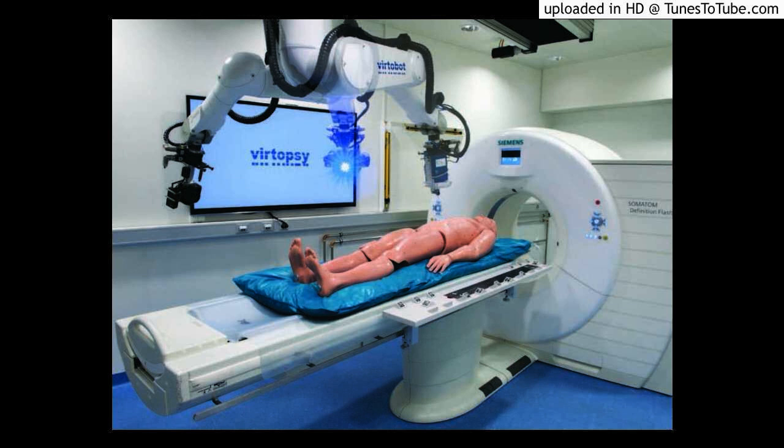Image-guided autopsy, or virtopsy, is a new technique which consists of internal examination of dead bodies using computed tomography, CT, and magnetic resonance imaging, MRI, without opening the body or body parts. It also allows the reconstruction of a three-dimensional view of the analyzed cadaver, thereby helping in answering main forensic questions without autopsy.